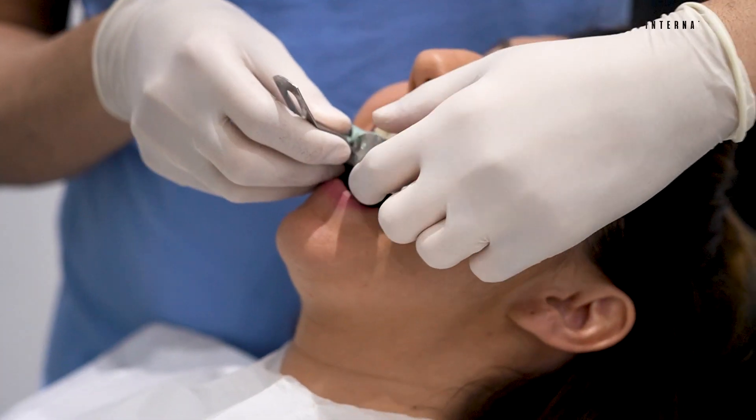After your dentist takes your measurements, he sends us detailed information. We pay attention to elements like gender, jaw structure, shape of your face, lips color, and skin color. Then, taking the expectations of our patients into account, which is the color that suits your desire from the scale.